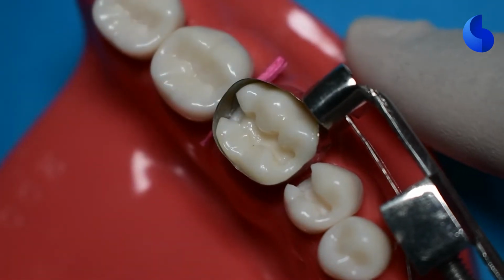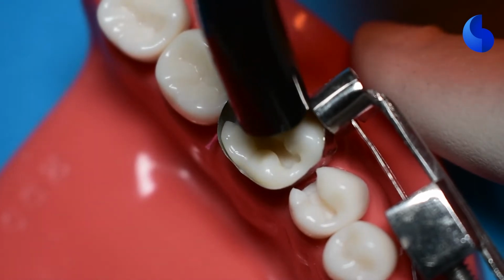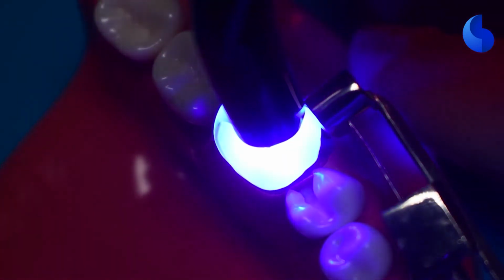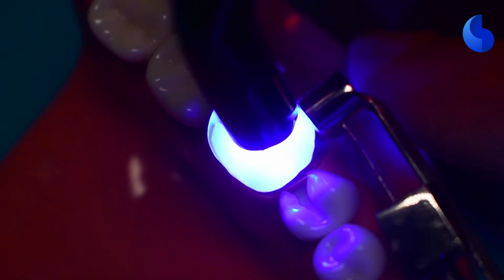And once you're done with that, make sure you burnish your matrix band to the adjacent tooth, to ensure that whatever restorative material you place inside ends up with a good contact.